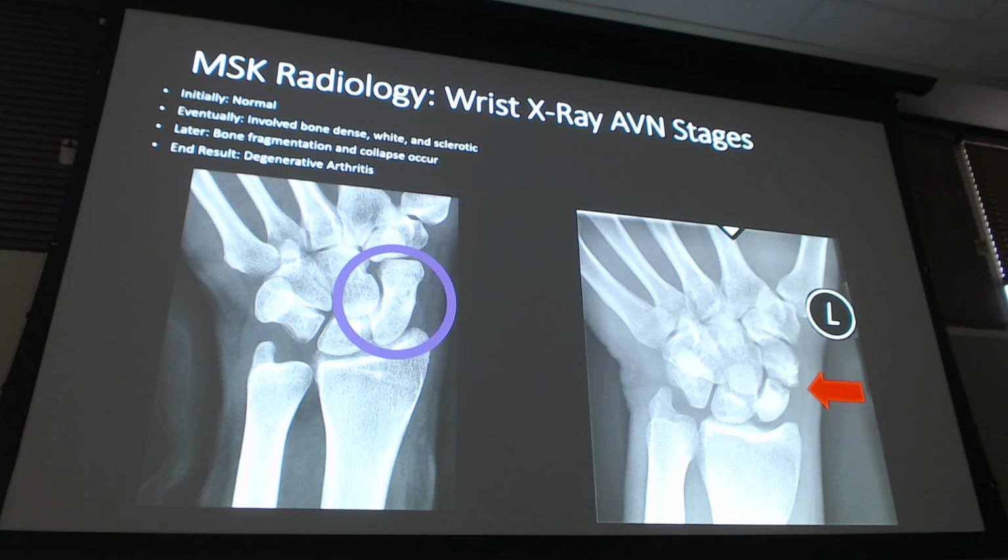Now, if you didn't pick that out in clinic, is that a big deal? This is pretty significant in the aspect of avascular necrosis. It's not if you give them the right counseling. And the correct counseling, like we talked about last time, is, hey, x-ray, maybe you missed it, right? It looks normal. Radiologist might even see it, like, I don't see any issues going on here. But if it's not any better in 7 to 10 days, I need you to come back so we can repeat the x-ray. If you give that counseling, missing that small little radiolucency in the purple circle from a clinic standpoint is perfectly okay, right? Because they're going to come back. You're going to reshoot the x-ray when they're still symptomatic, and it might look like this.